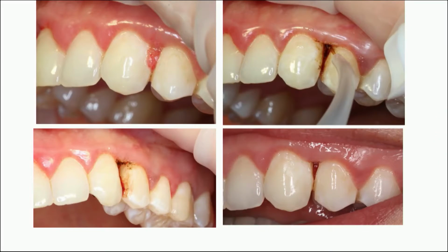And there have been a number of studies done on that. Here's a patient who has a periodontal lesion, which happens to be an angiogranuloma. We've gone there with the laser to excise that, but also to treat the area so that the inflammatory condition which led to this isn't going to recur. So once again, we're trying to use the same three features, but now to modulate the effect of what we're actually getting.